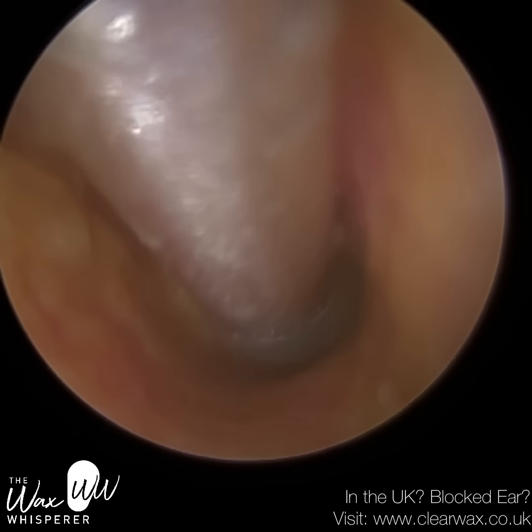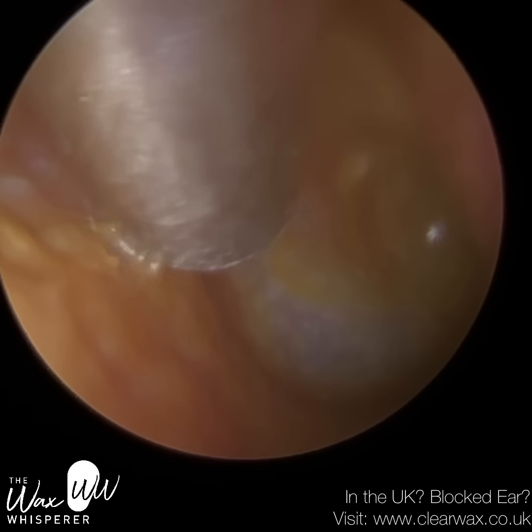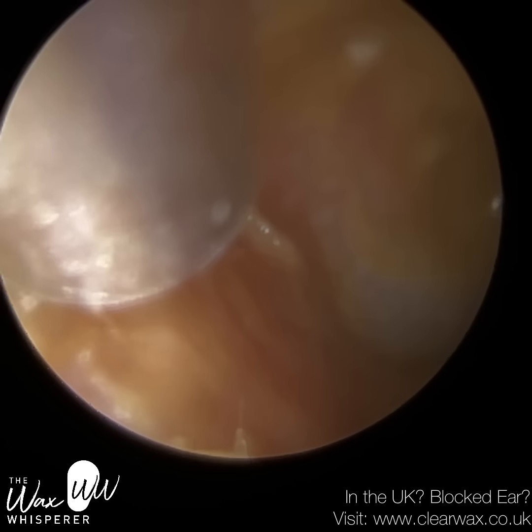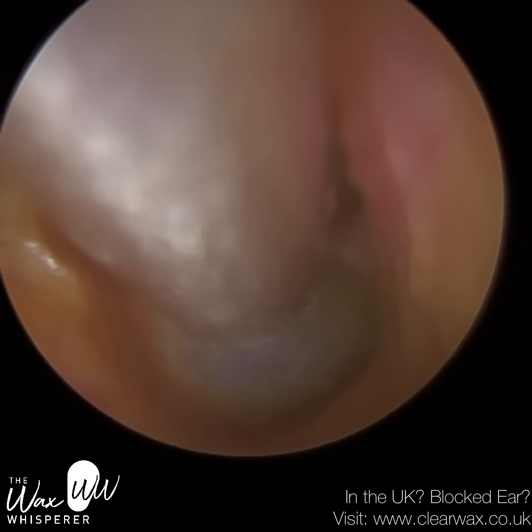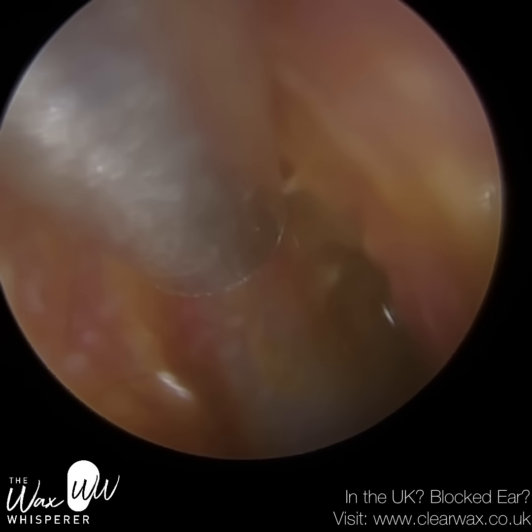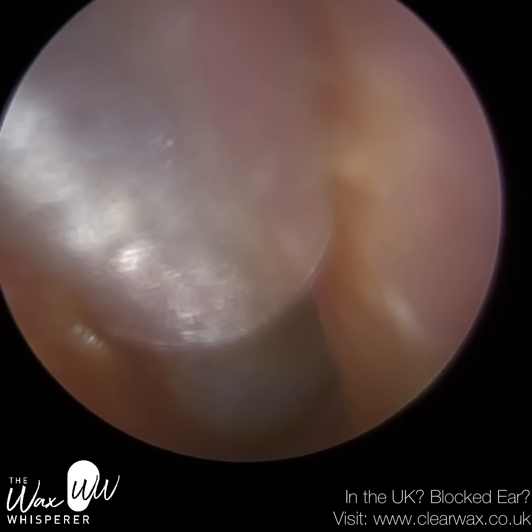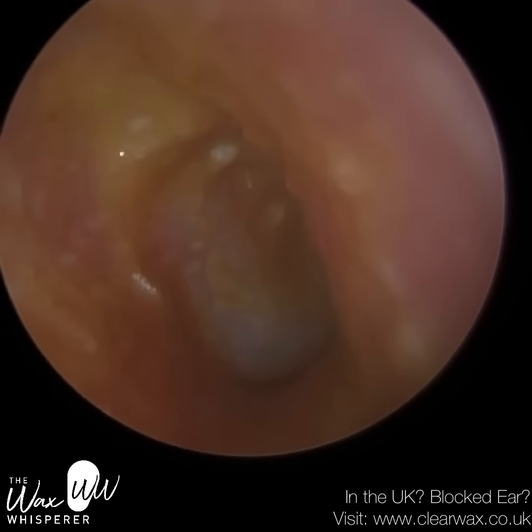So I've just put some more drops in. I just want to see if I can get a bit more debris away. We have written to the patient's GP, because they will need some prescribed medication for this. Again, I've just got to keep mindful of the anterior canal wall there. I think I'm at the moment using the big sucker. I've just reverted back to get more of a surface area, and I've got a feeling I'm going to revert back to the fine end again in a moment.